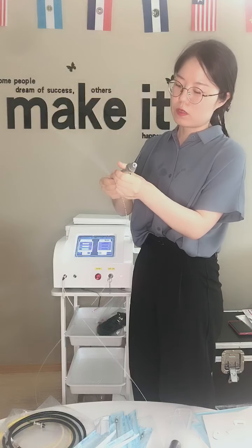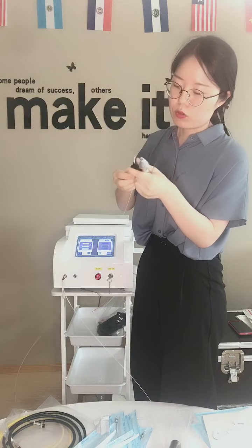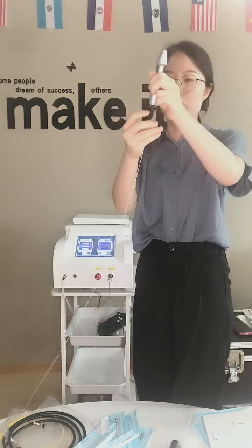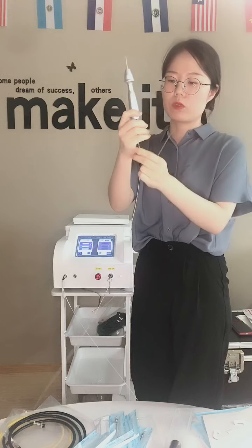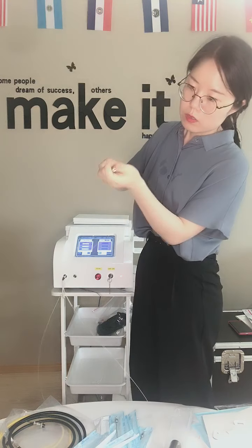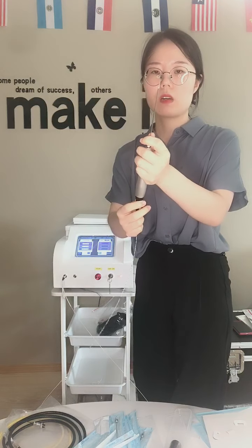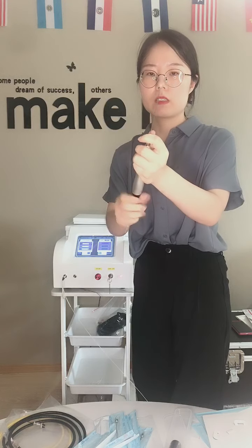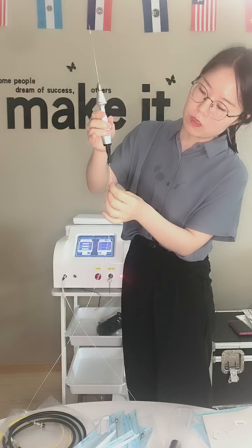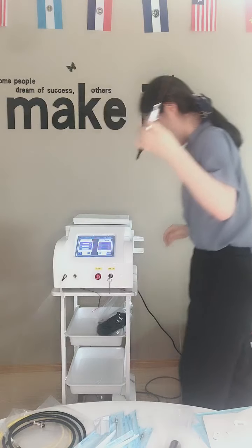Because this fiber is different from the radial fiber, when it's working, the shape of the light is totally different. Later I will show you, you will know. Putting it on. This black part is to fix the fiber, so when you're doing treatment, the fiber won't get out. It's the same function as on the other handpiece. Here, we need to make the sharp glass tip out of the needle and then tighten this black piece here. Make it tight and you can see there is space. The fiber won't move or get out of the handpiece. Okay, now I will show you how the handpiece is working.